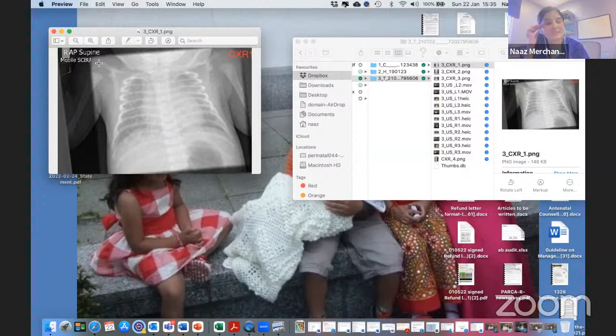In the neonatal unit, we initially put the baby on Vapotherm at 8 liters and then changed to CPAP. So this is the X-ray on CPAP. As you can see, it's an AP view of the baby supine. You can see the NG in situ and multiple infiltrates bilaterally and no sign of pneumothorax on the X-ray. The gases showed persistent respiratory and metabolic acidosis, and the baby was in 100% oxygen with no pre and post ductal difference.